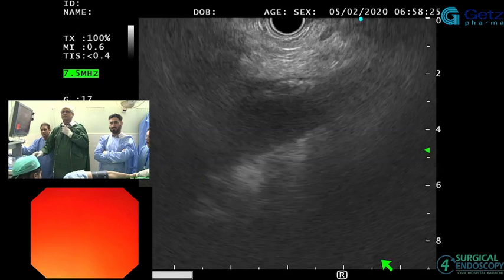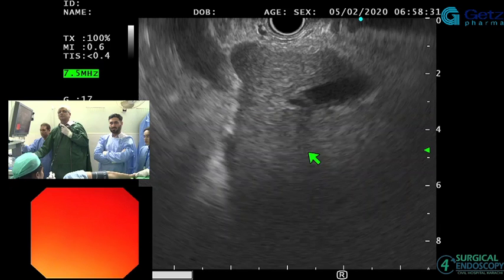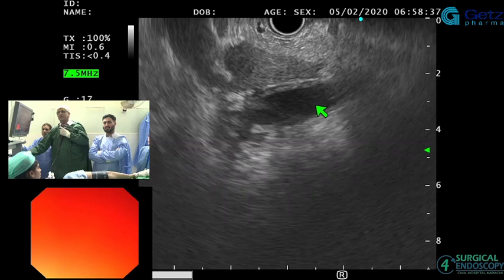Doc, what is this? What is this? Hai toh vessel. Aur ye bhi vein hai. Kya ho sakti hai? Liver mein hai.